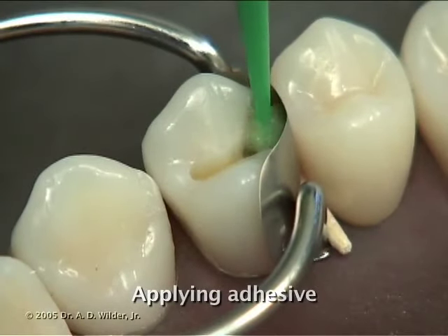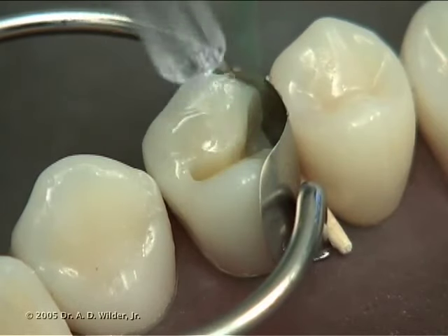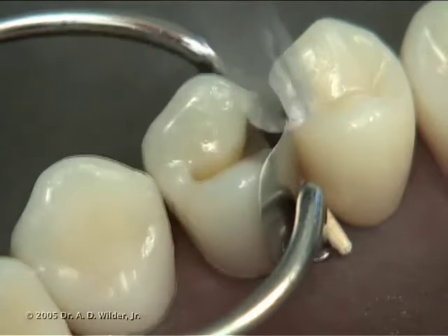Apply prime and bond adhesive with a microbrush to all walls and floors of your preparation. Gently air thin the bond to evaporate the solvent and then cure for about 10 seconds.